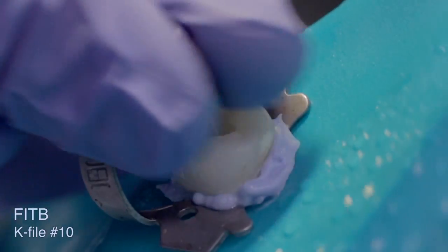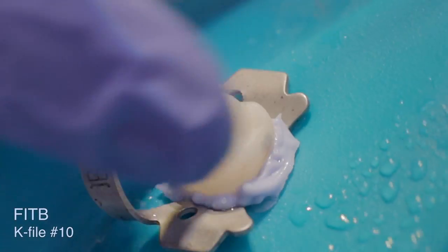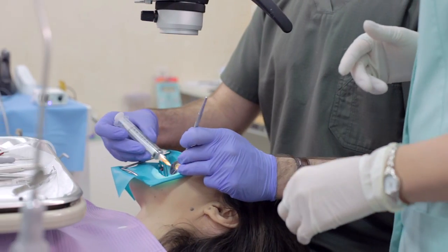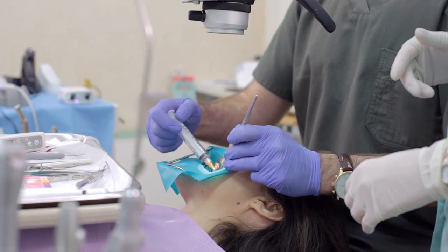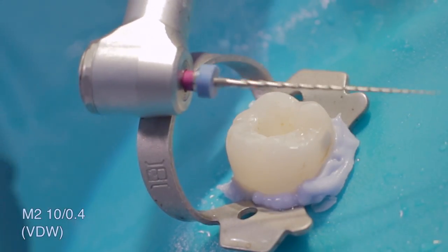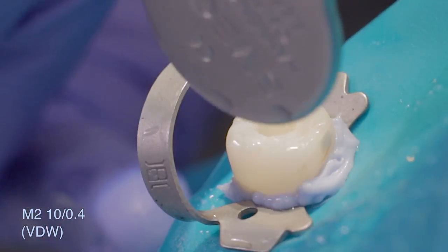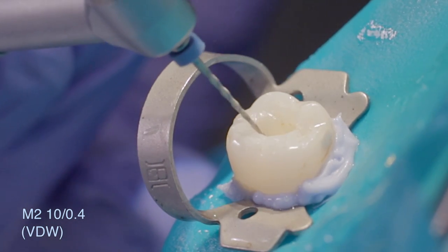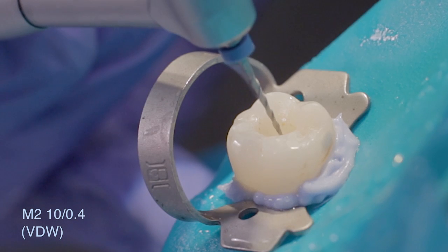This canal was classified as a complex canal. An NiTi rotary file system was selected to prepare a tapered glide path. Information regarding additional glide path options can be found in the SAF System Clinical Guidelines Manual.